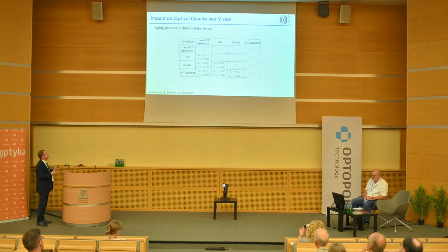We also checked the impact on optical quality and vision, and we can see that the description of the lens OCT signal with respect to the OSI, so backscattering versus forward scattering, there is some correlation between those two parameters.